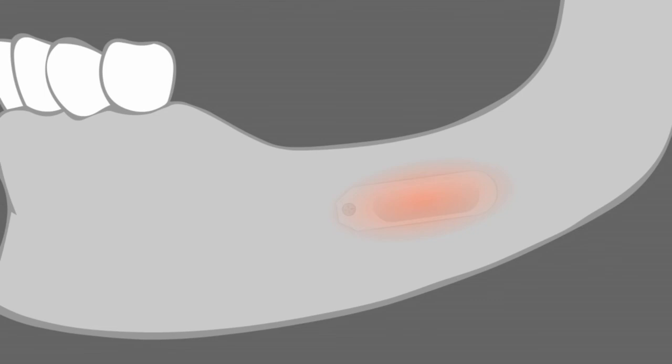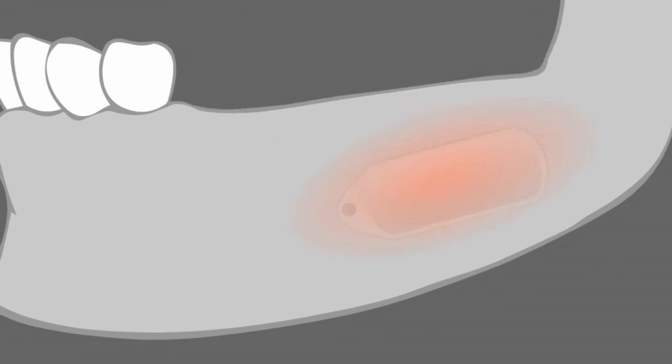Usually, tissue expansion and maturation are completed after 6 to 8 weeks. The expander is removed in the course of augmentation surgery. Incision and flap design are chosen as required for the intended method of bone augmentation. It is possible to cut directly into the expander.